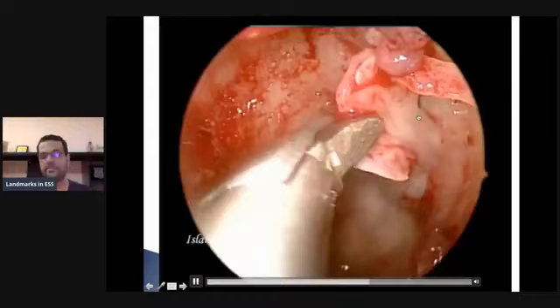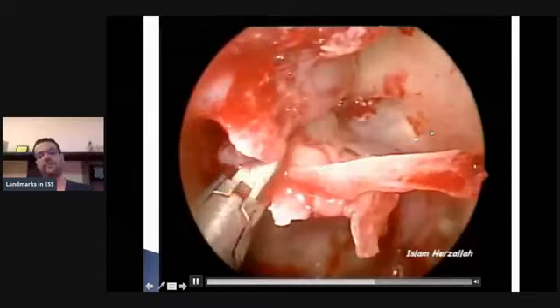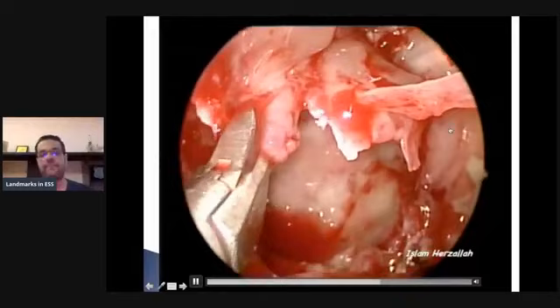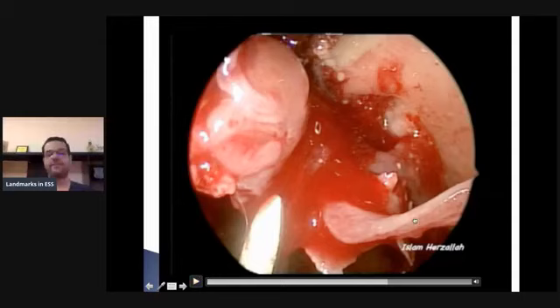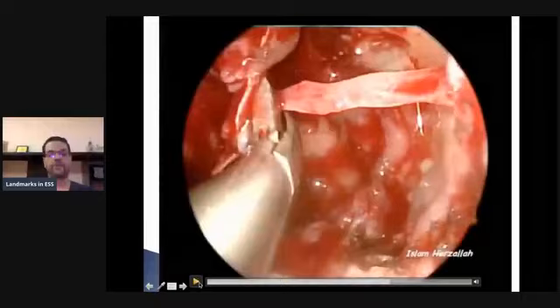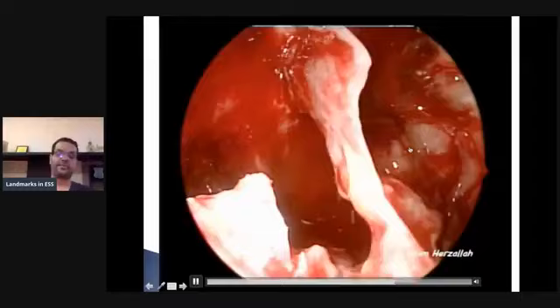But you see this mucosa right here. You know the anatomy from your CT and MRI, and you also have the navigation there. But you see that this seems like a mucosal band. The mucosa on the left side of the septum, as you remember, we have a very narrow left side of the sphenoid sinus, and we have this mucosal band on the left side of the septum. So I'm now clearing it, see? By the way, once this was cut, I thought, oh, it looks scary, since it's a very tough band from the chronicity of the disease that the patient has had.